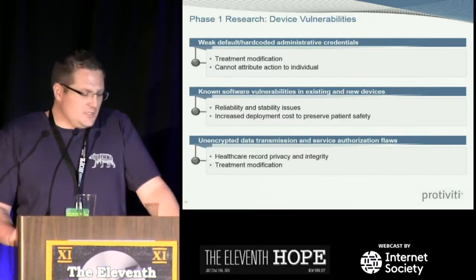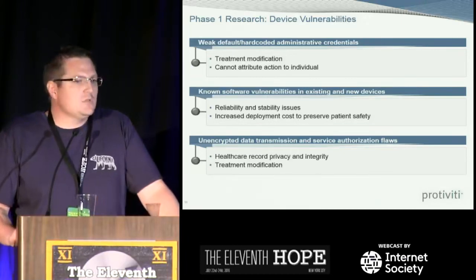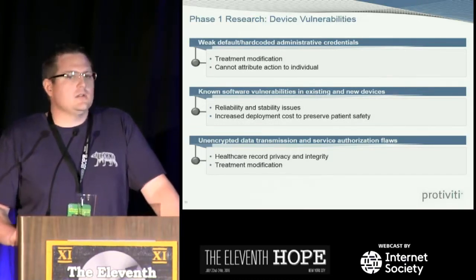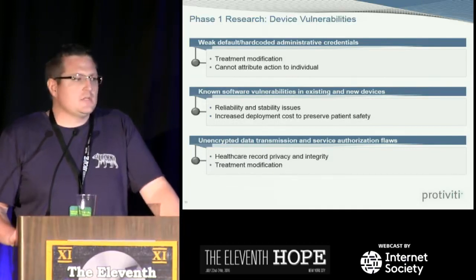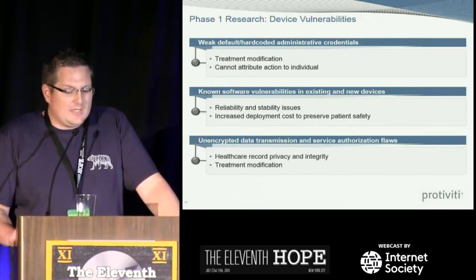The second is known software vulnerabilities. And that's, to Adam's point, we still do have a lot of XP, even older, 2000 NT, that we see regularly still in operation, legacy devices with known vulnerabilities that are open to exploit. And lastly is lack of encryption.